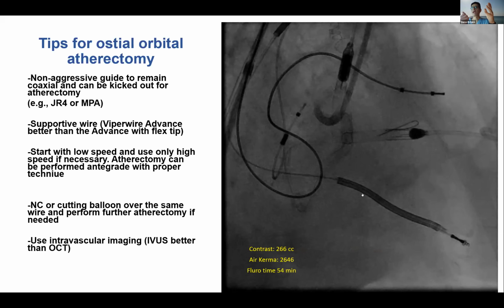This way, you don't have the issue of the wire wrapping around the rod of the guide extension, and you don't have the issue with the crown or burr not making it all the way to the tip. Again, it can be done both ways. Nikos Kakouros had a case report of this a couple, three years ago, and it works very well.